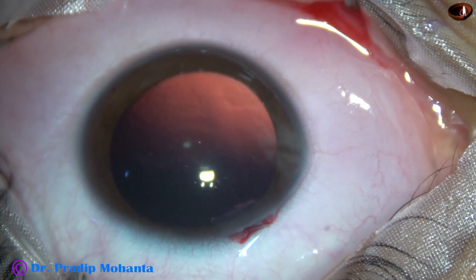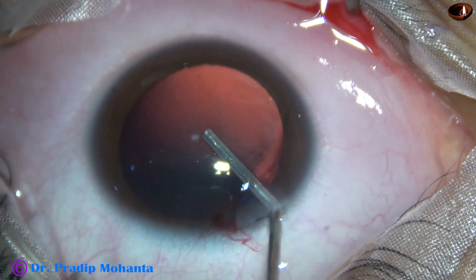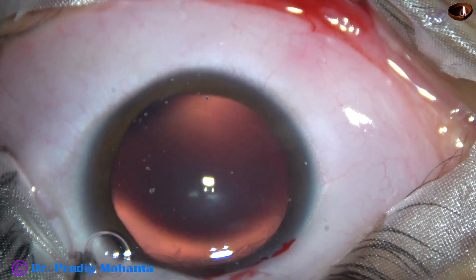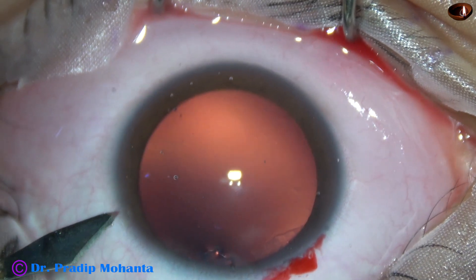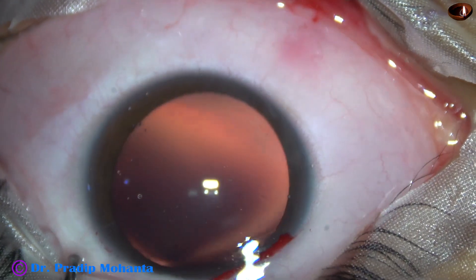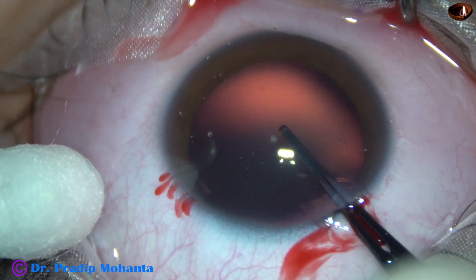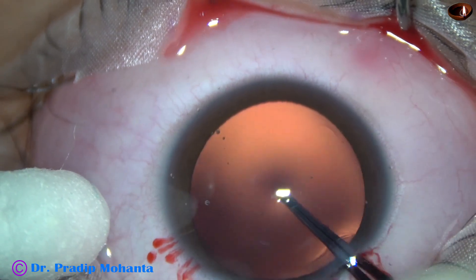After explaining all the pros and cons of phakic IOL and clear lens extraction, the patient opted for clear lens extraction and intraocular lens implantation. I have started the surgery. The main incision has been made; one side port has also been made on the left side of the main incision. Now, capsulorhexis is being performed.